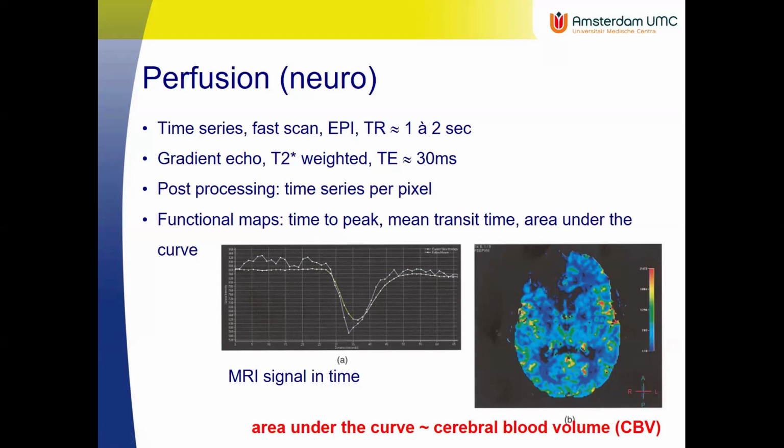And that means here you can see a perfusion defect in this area in the brain. There's no blood present. So this is a serious issue for that patient. You can also see there's some hot spots, which are probably larger veins, larger arteries supplying the blood.